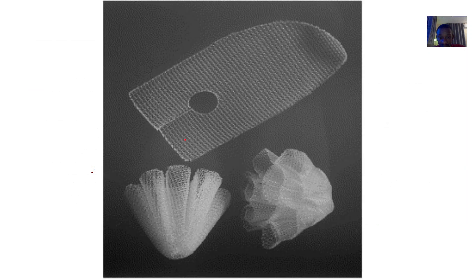So these are the meshes — you fold the mesh into that plug and fix it inside the hernia defect.